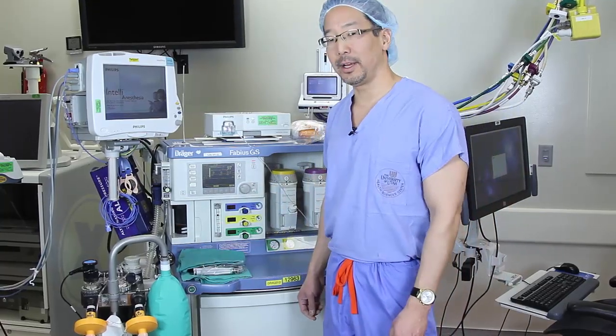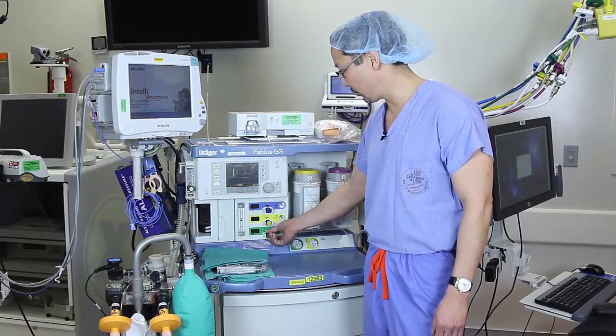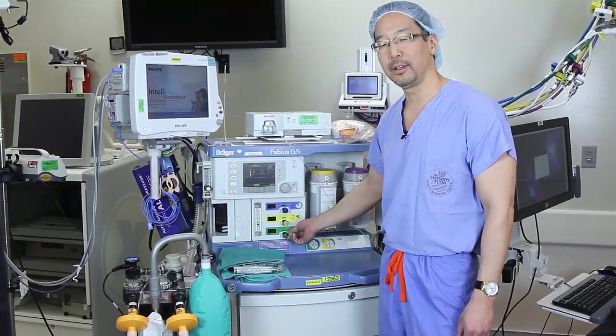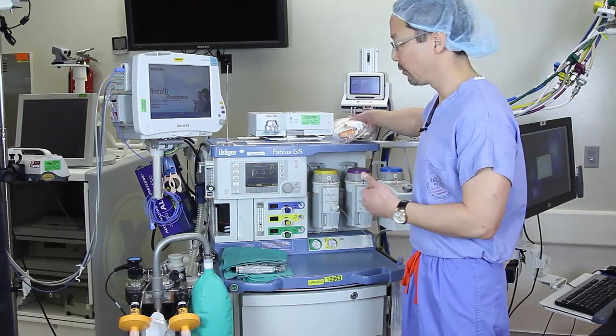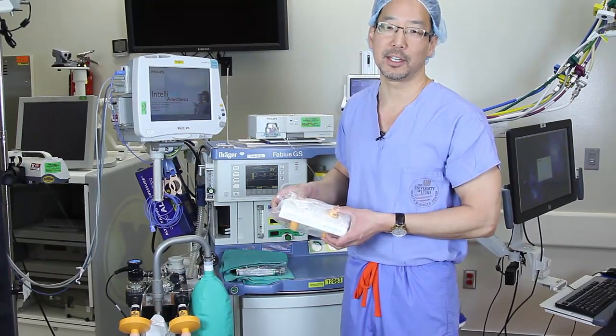With the VaporClean filters in place, I can now be confident that I can run my fresh gas flows at 3 liters per minute for up to a 12-hour case. If the case should last longer than 12 hours, we recommend replacing these filters with a new set of filters to maintain your patient's safety.